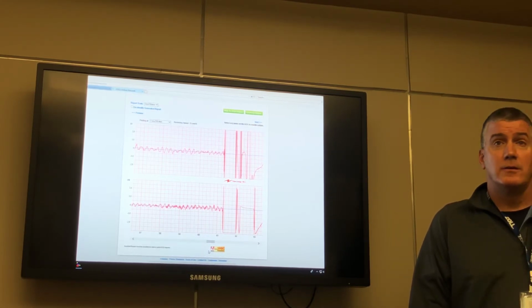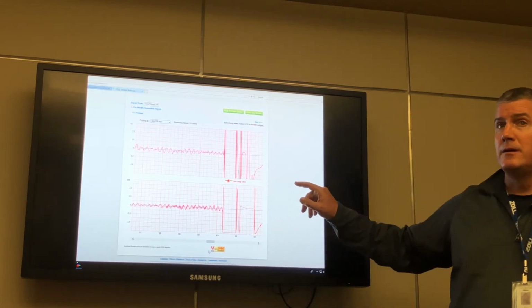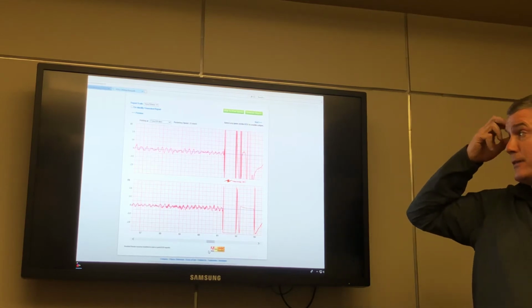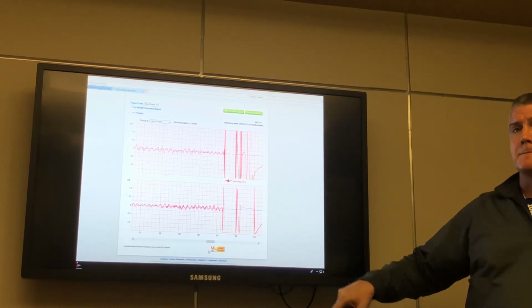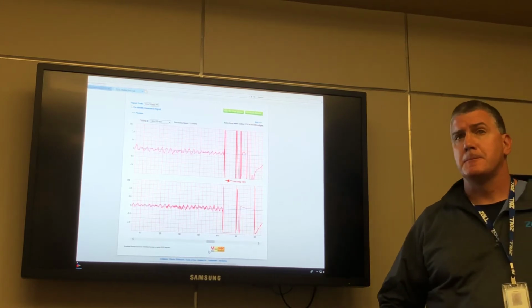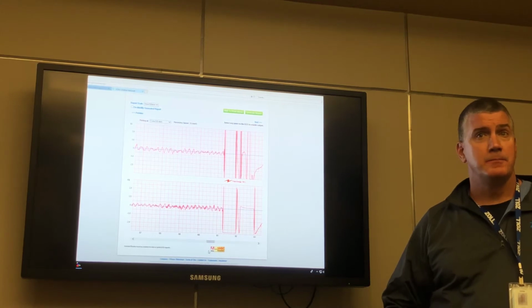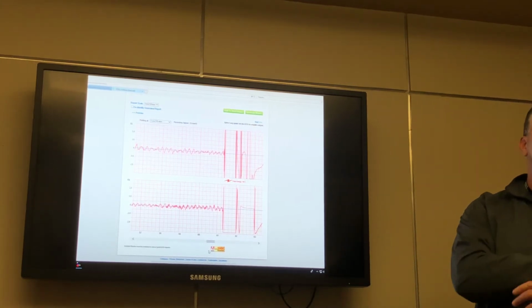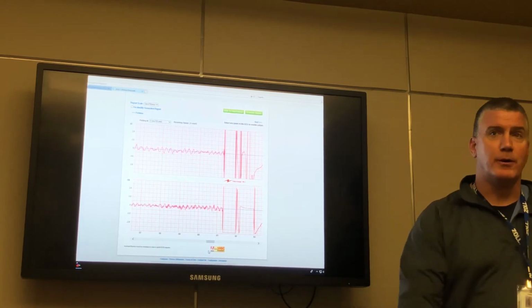And can you get an EKG from each of those heart rates, where those dots were? No, so only on the recordings, you mean? Yeah, so you've got this EKG right now, and then you would show the heart rate. You know, those dots of heart rate, can you do an EKG for each of those? No, because that would be like a Holter recording. That would be a lot of information. We'd have to get a wheelbarrow to bring all the paper.